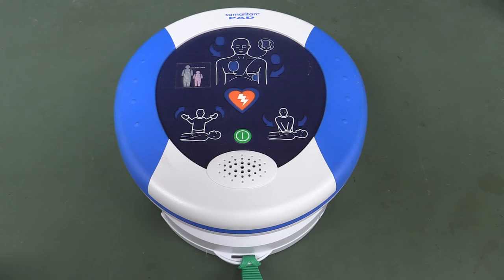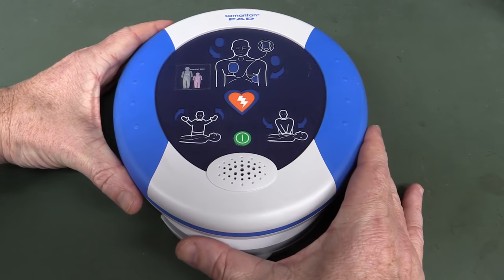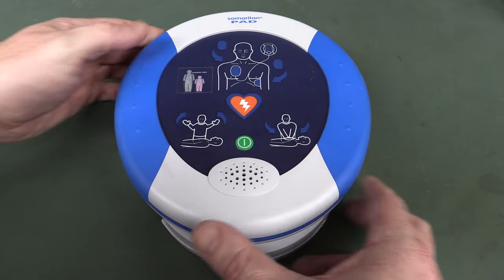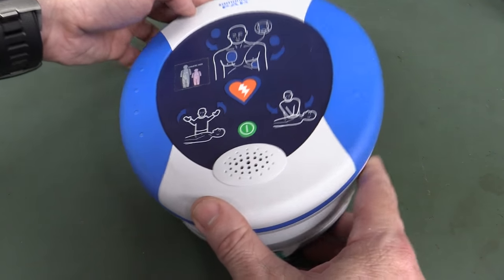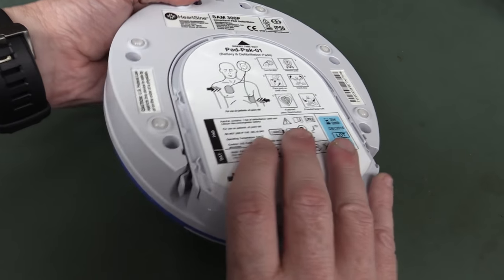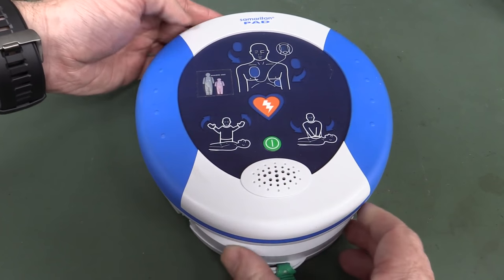Hi, welcome to Teardown Tuesday. We've got an exciting one for you today. It's an AED, an Automatic External Defibrillator. This one's called the Samaritan Pad, and these are of course designed to shock your heart and restart it if you have a heart attack.